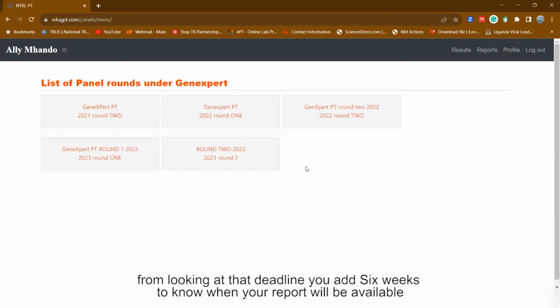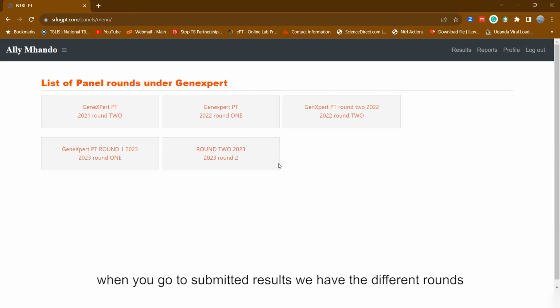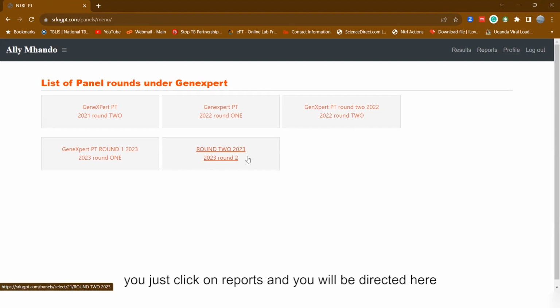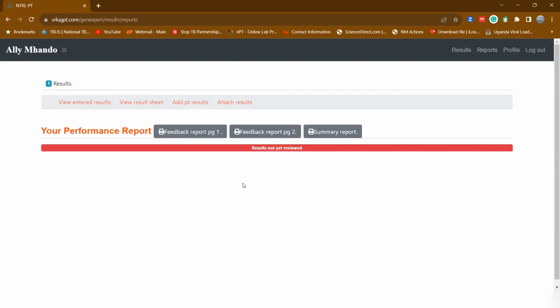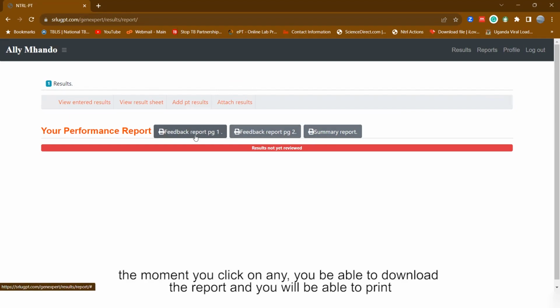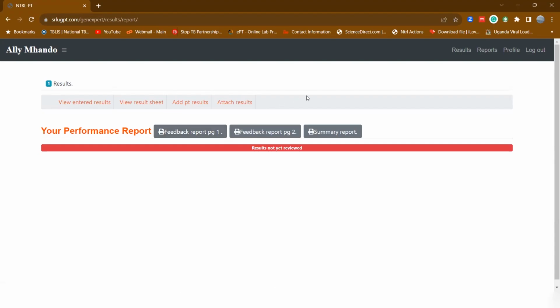When you go to submitted results, we have the different rounds. You just click on reports, and it will direct you here. So I'll go to round 2. I'll look at feedback report 1, feedback report 2, and summary report. The moment you click here, it will automatically download the report, and you'll be able to print. Thank you.